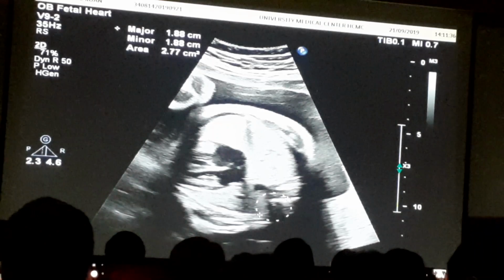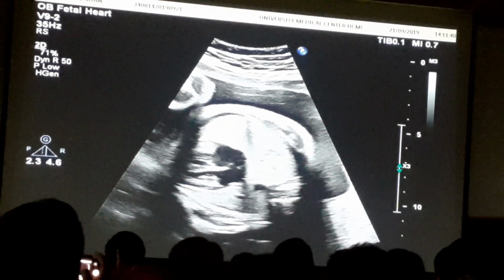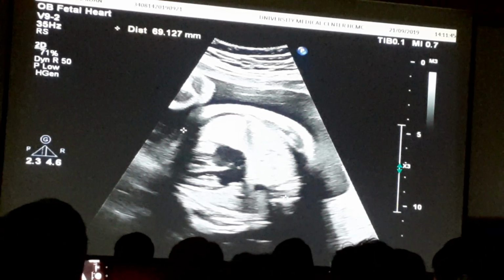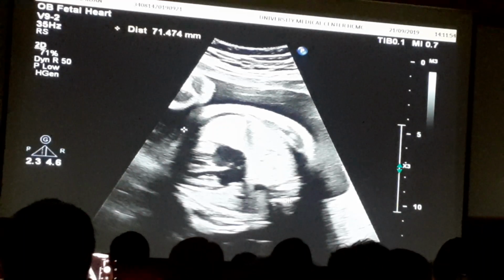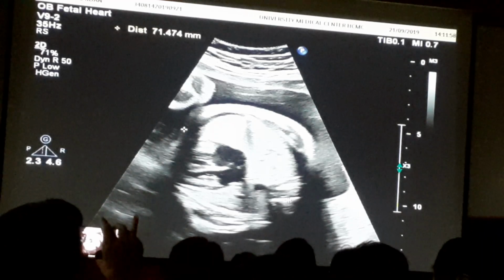So if we just draw a line from the spine to the anterior chest wall, no, it's not working. Đây là mình vẽ cái đường tương tự từ cái cột sống ra cái xương ức. I would want to draw a line. Em có cái đường liền luôn không để người ta thấy hai cái điểm đó nối ra một đường liền.